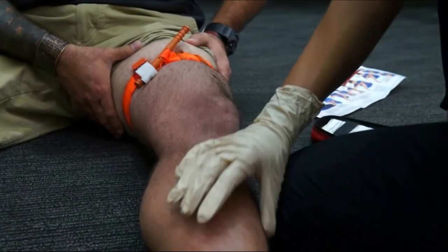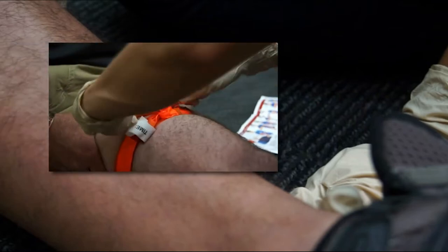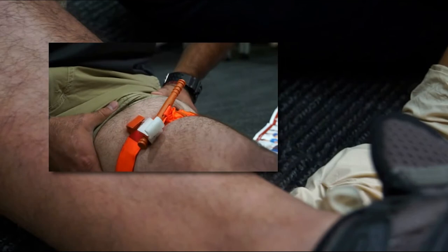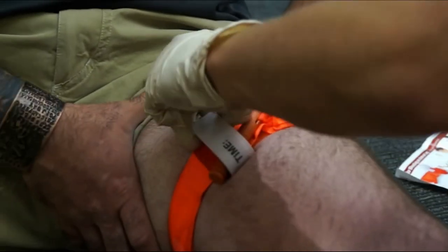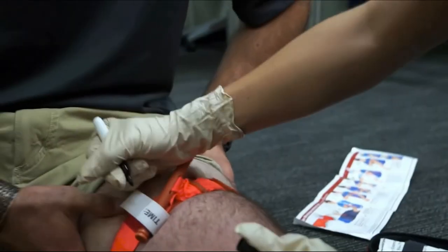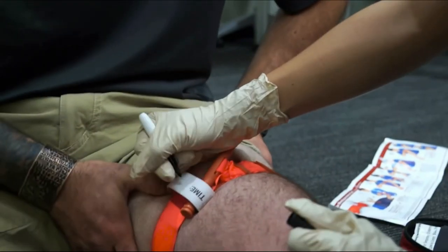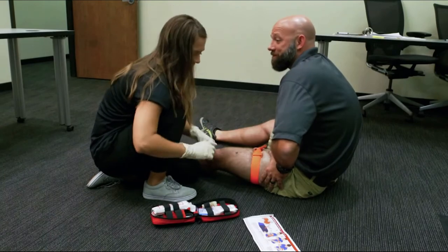Check for bleeding and distal pulse. If bleeding is not controlled or distal pulse is present, consider additional tightening or applying a second CAT above and side-by-side to the first. Re-assess. Secure rod and band with time strap. Record time of application on the time strap with the permanent marker included in the kit. Assure the patient that help is on the way.